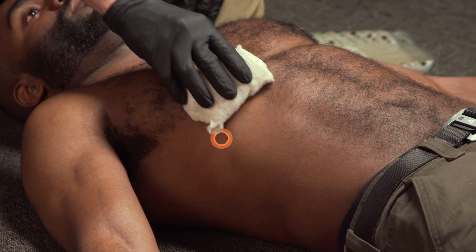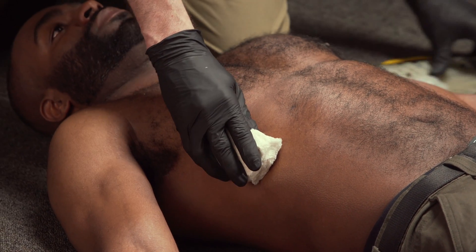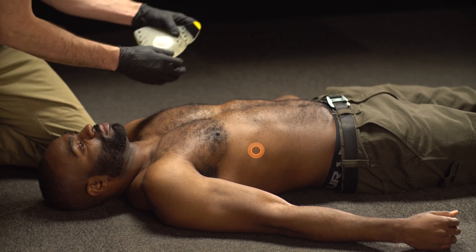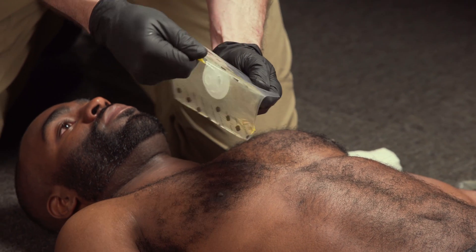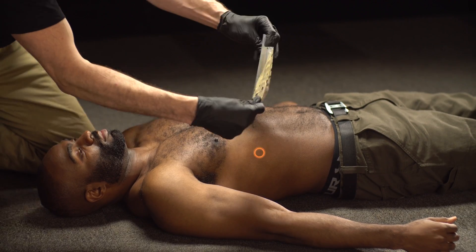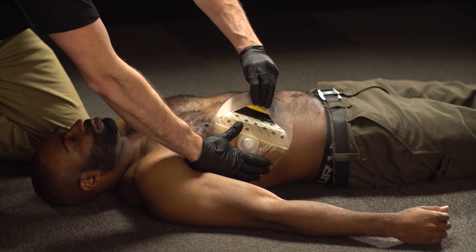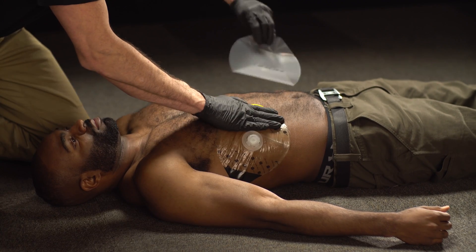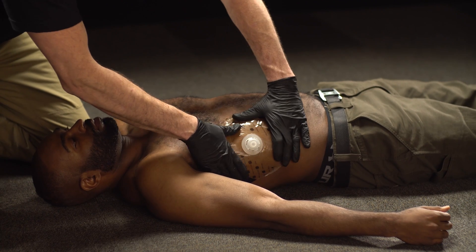Clean the wounded area. Next, grip the application tab and remove the clear liner. Center the TruFlow valve over the wound and place the dressing adhesive side down before pressing firmly across its entire surface to ensure adhesion.